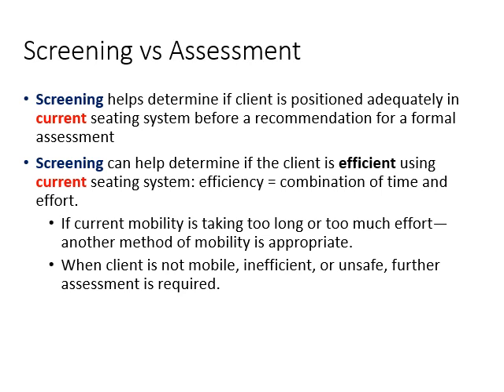And efficiency itself is defined as a combination of the time and effort that are required to use the system. So if the mobility currently is taking too long or it requires too much effort, then another method of mobility may be appropriate, meaning that it might be time to look at a different wheelchair and seating system.